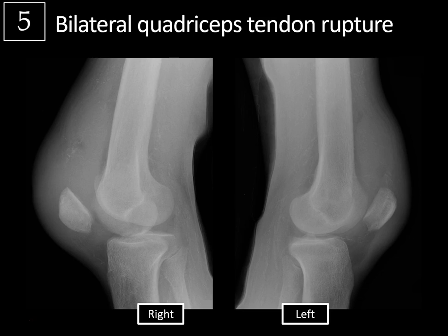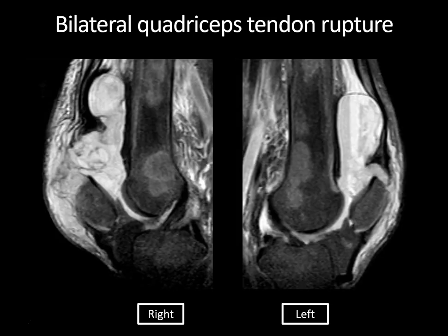The typical appearance includes low-lying patella, dystrophic calcification, and an indistinct bulk of the quadriceps tendon. You might also see bone resorption. On bilateral T2 fat-suppressed sagittal MRI images, the quadriceps tendon on the right is completely ruptured with a large tendon gap from the superior aspect of the low-lying patella, and a ribbon-like appearance to the collapsed patellar tendon. A similar but less pronounced appearance is seen on the left, with quadriceps tendon rupture and undulating partial collapse of the patellar tendon, plus large bilateral suprapatellar joint effusions and extensive subcutaneous edema.